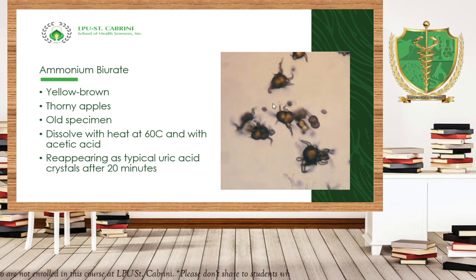be asked for recollection because it means that the specimen is old. Okay? It dissolves in heat at 60 degrees Celsius and acetic acid. Okay? Appearing as typically uric acid crystals after 20 minutes.